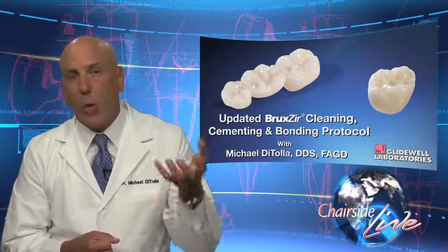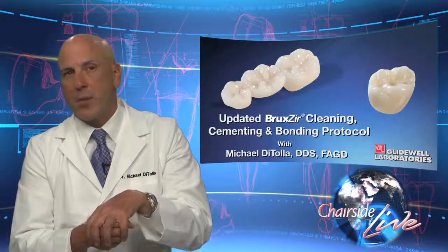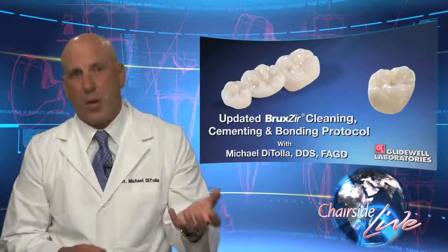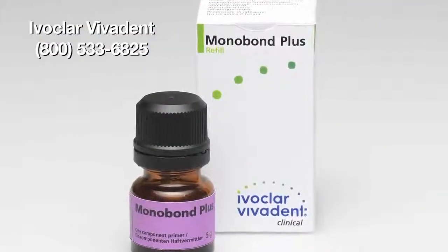It could just continue to go on and on. So when a BruxZir crown or a zirconia-based crown has been tried in the mouth and then it's taken out, the Ivoclean needs to be used to freshen up the surface of the crown on the inside so we can now get something to stick to it. What are we going to get to stick to it?